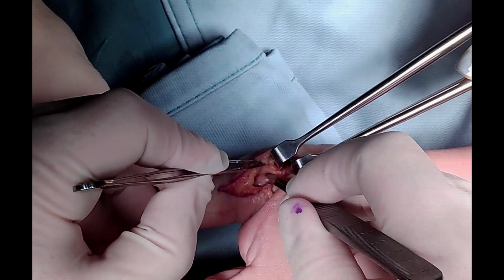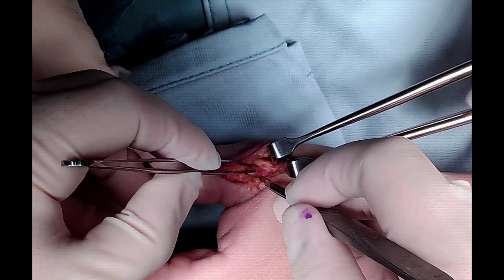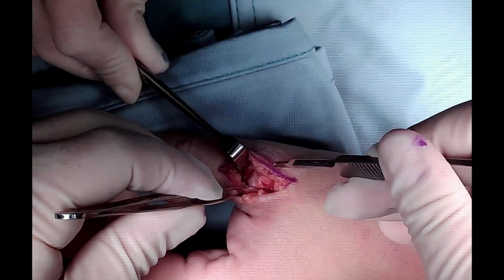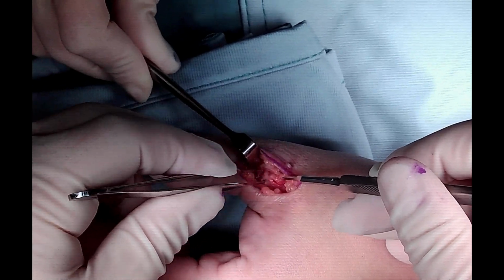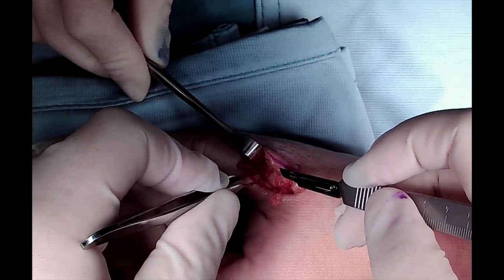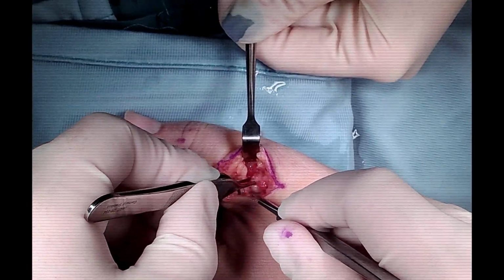The aponeurosis is connected with the extensor mechanism, so we elevate the extensor mechanism up in order to find the collateral ligament, the ulnar collateral ligament. What we are holding now is the ulnar collateral ligament, come to view with the help of some irrigation.